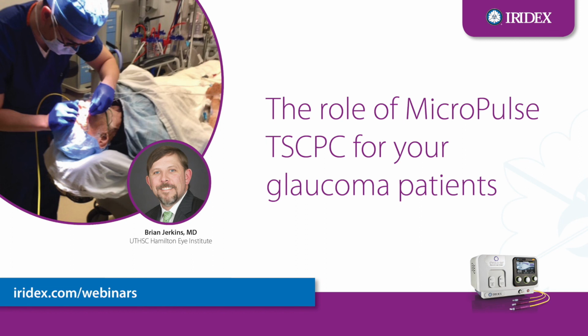So it's really a big call out to make sure that the technique is maintained, that you're staying off the limbus, that the angle is appropriate and aiming towards the center of the globe, and that the orientation of the probe is proper so that that fiber is moved away from the cornea as opposed to closer to it.